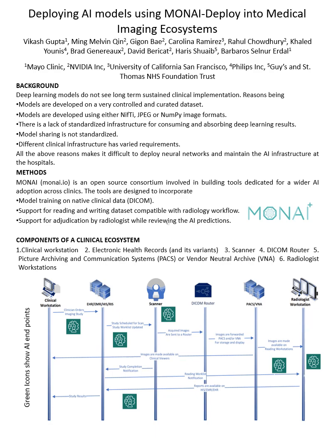Another reason for such obstacles in the deployment process is the datasets used in training are either in Nifty, JPEG if they are 2D, or NumPy image formats. Such datasets are not native to a clinical infrastructure. These datasets in clinics are comprised of DICOM, which is a fairly flexible imaging standard used in hospitals. This flexibility often makes it difficult to handle such images.